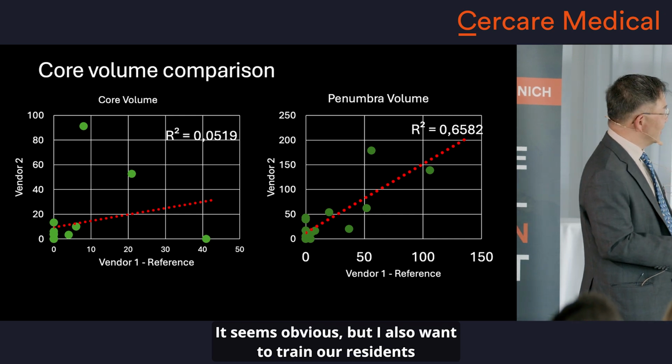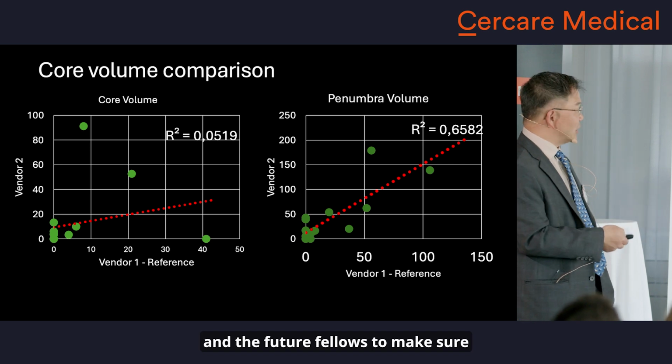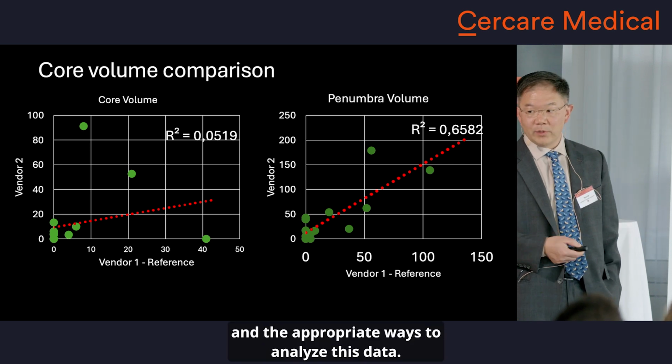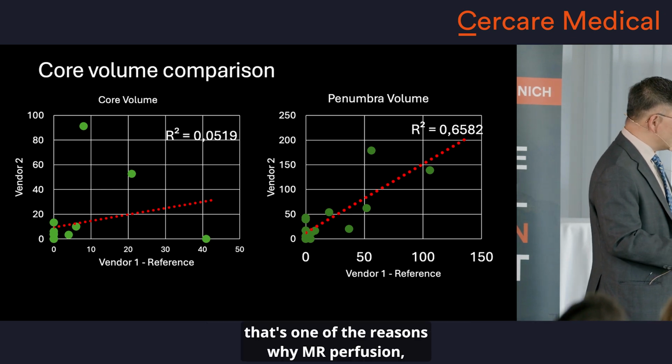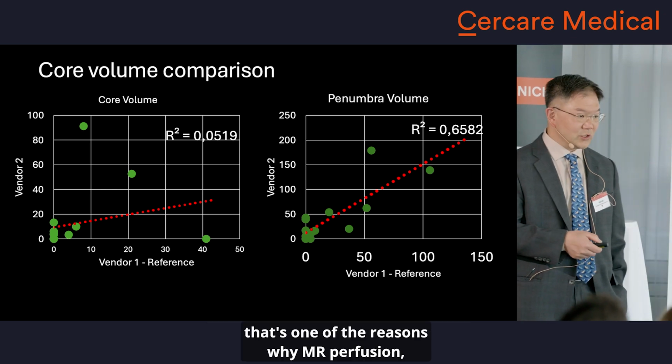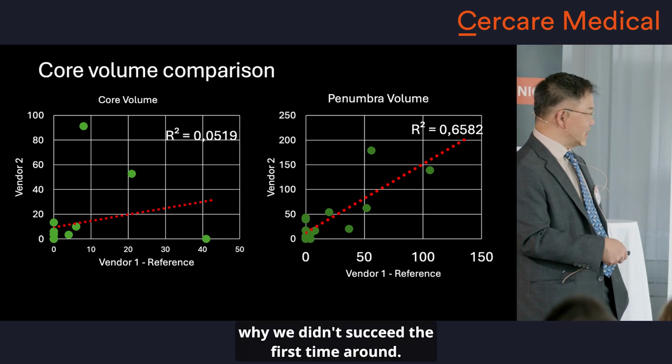It seems obvious, but I also want to train our residents and the future fellows to make sure that they're thinking about this and the appropriate ways to analyze this data. For those who've been around the block a couple times, that's one of the reasons why, you know, MR perfusion, if you hear the old stories, why we didn't succeed the first time around.